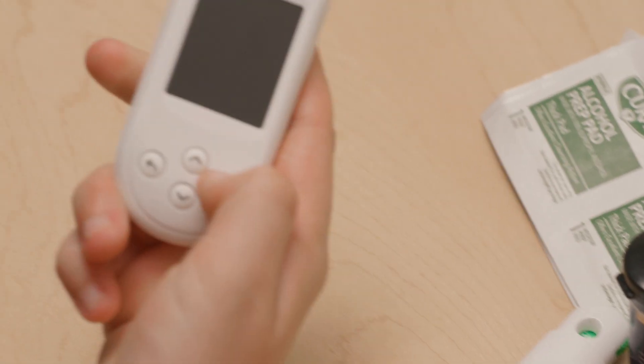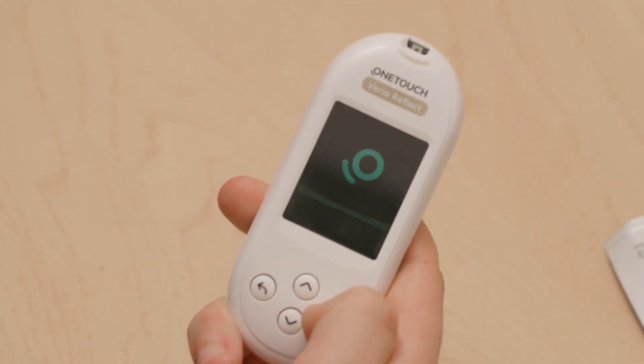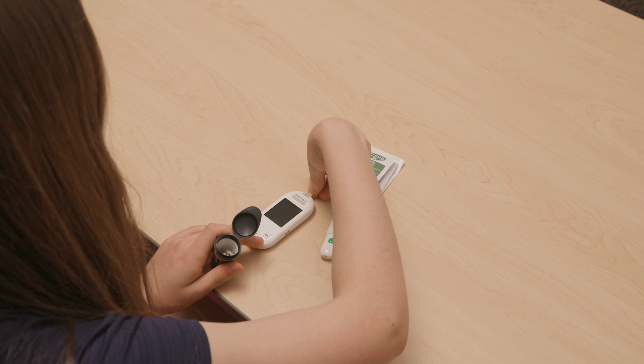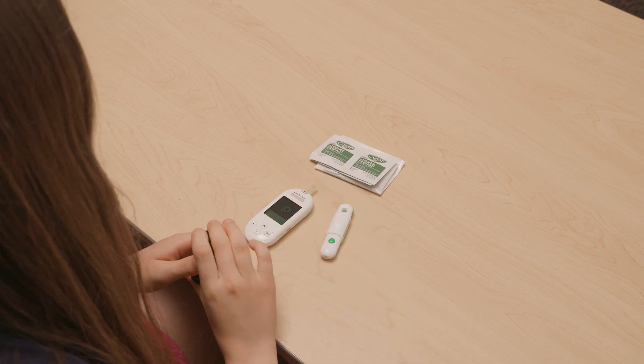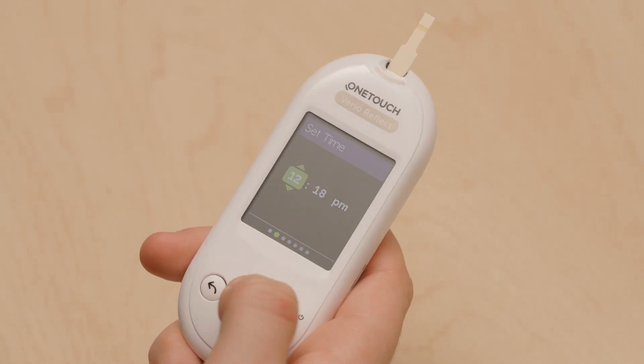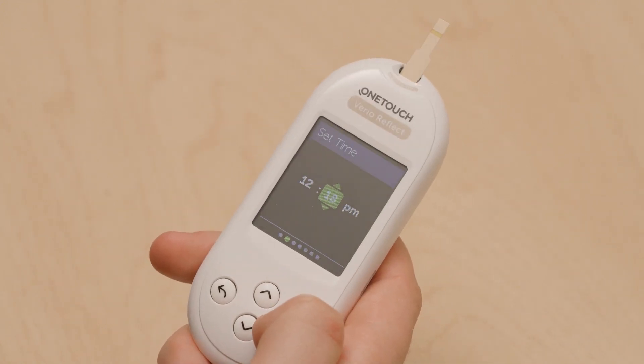To set up your meter, you can turn it on one of two ways. You can push and hold down the power button, or you can put in a test strip and it turns it on. The first time turning on your meter, you will need to set the date and the time. This is very important to make sure your numbers are being recorded on the right date and time.